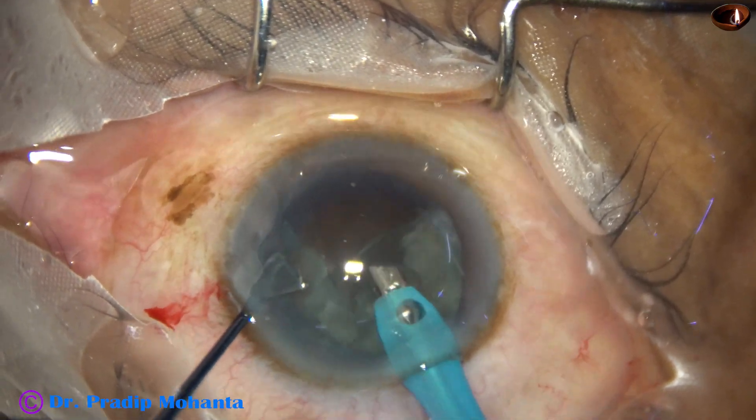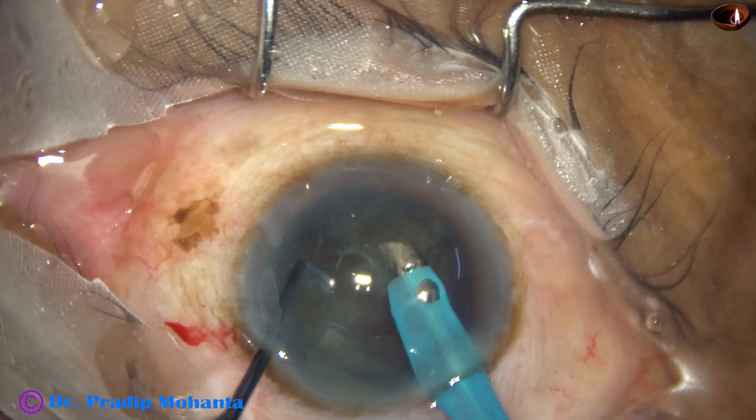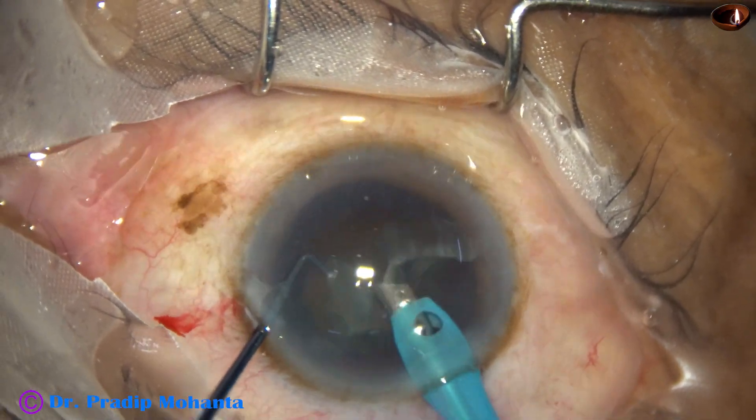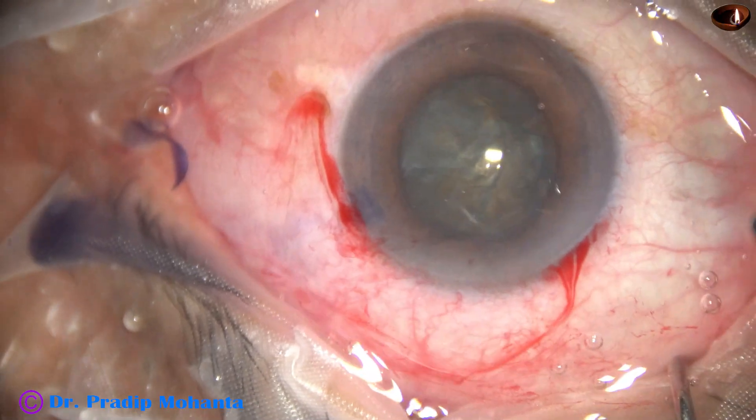The most beautiful thing is we divide the nucleus in the capsular bag — we do not prolapse the nucleus into the anterior chamber — so there is least chance of endothelial cell loss.